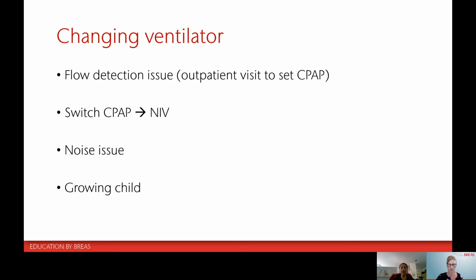We had some cases with patients on NIV that were put on an intermediate device, and because of the IPAP level, the child and the brother or sister sleeping in the same room, or even sometimes the parents, felt that the device was too noisy. So we know that some devices that can do exactly the same job are less noisy than other ones.